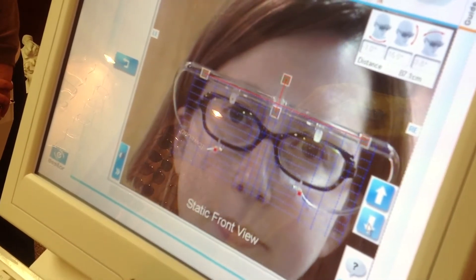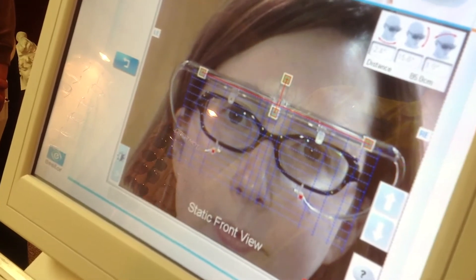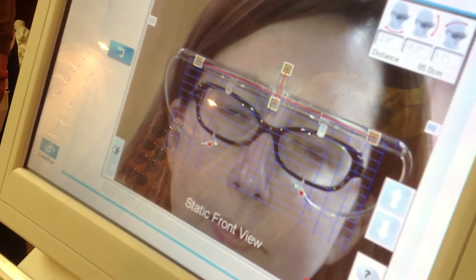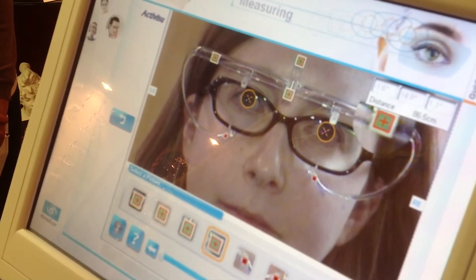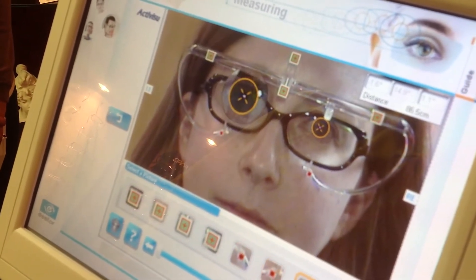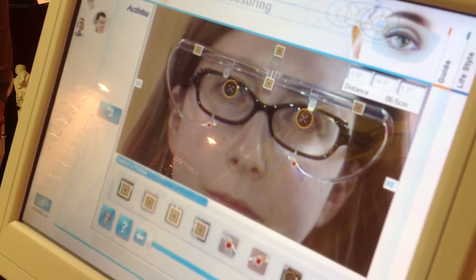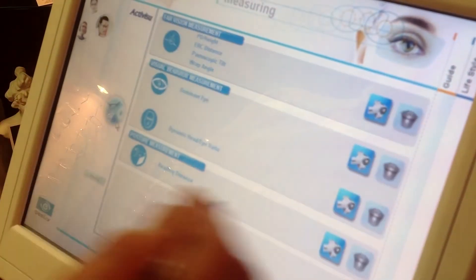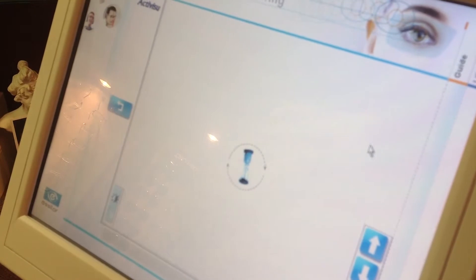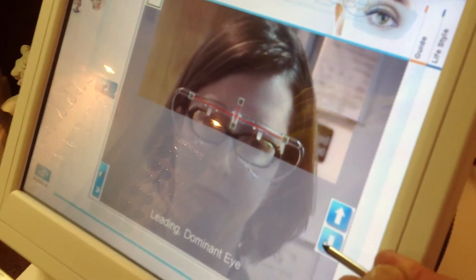Jackie, just look straight ahead at your own eyes in the mirror. This only takes a few seconds to perform, and just that fast it's done. It's going to go through a checking scan just to be sure it's happy with all the measurements. Once it's complete, we're ready to move on to stage number two. Jackie, just take a step back. And we're going to do her dominant eye, which is a very important feature to have in a pair of glasses so that you maximize your performance with them.